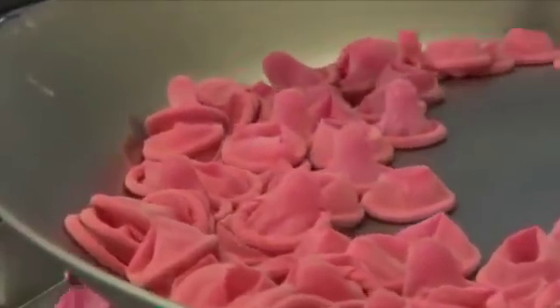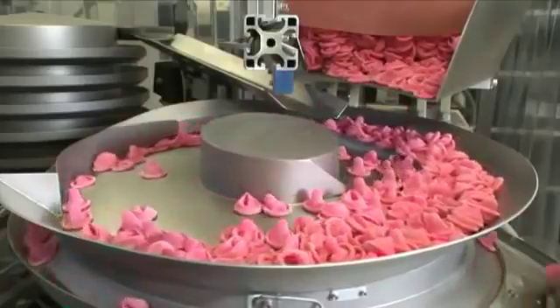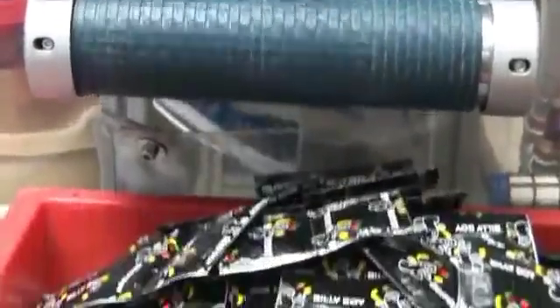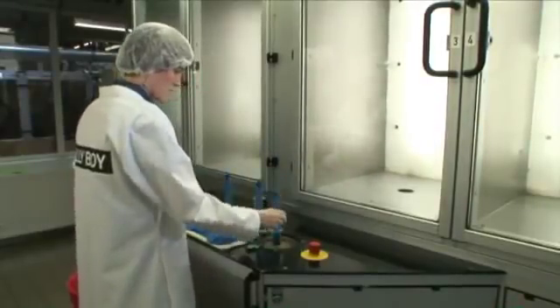Once tested and rolled up, the condoms can now be wrapped into their primary wrappers. Fully automatically, each condom is sealed airtight into its own sealing foil. Here, each condom type also receives its specific lubricated coating and aromatic flavor. To meet the consumer's high quality requirements, these sealed condom batches are now subjected to a whole series of elaborate inspections and tests.